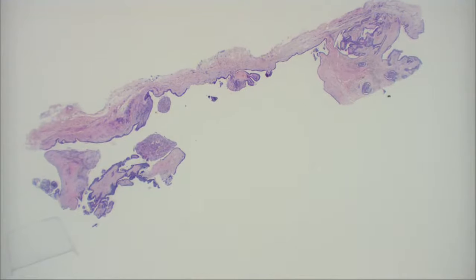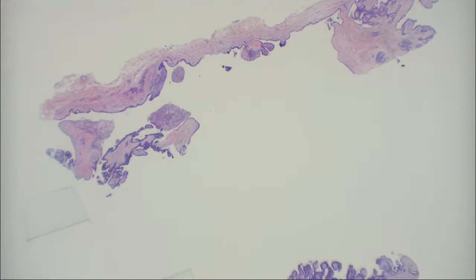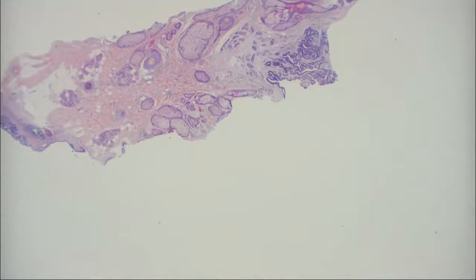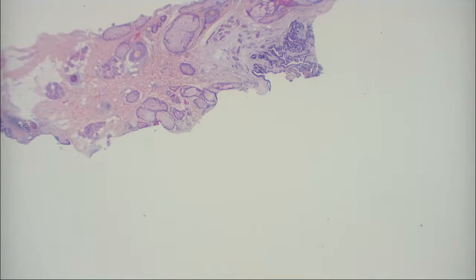If we see something that we think might be enucleation like that, it's often because clinically they think it's a cyst. Do you think they might have thought this was a cyst clinically? That's what I thought from looking at it. That's probably a lining right there. So it is a cyst in part. Now, not everything is a cyst. You've got some other stuff going on over here, but it looks like a cyst. So clinically, they probably thought, okay, this is probably just a regular garden variety cyst, and they enucleated it out. And guess what? It's not just a regular isthmus catagen or trichilemmal cyst, is it?